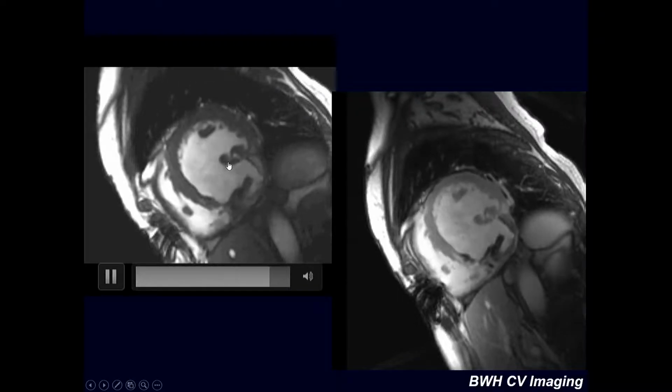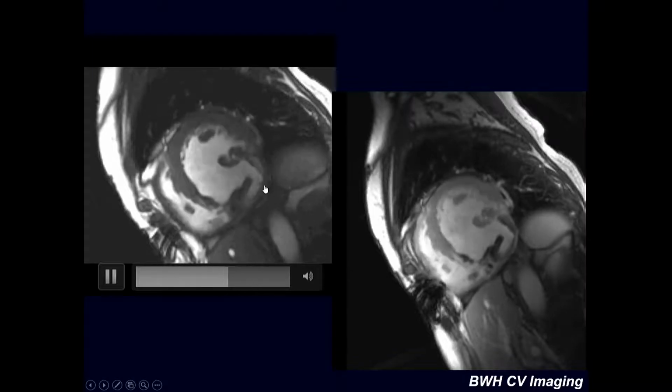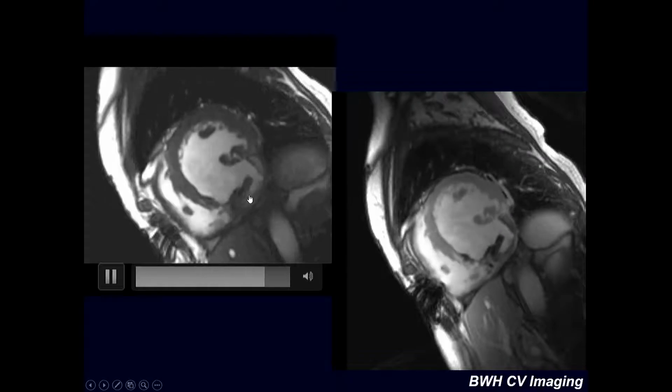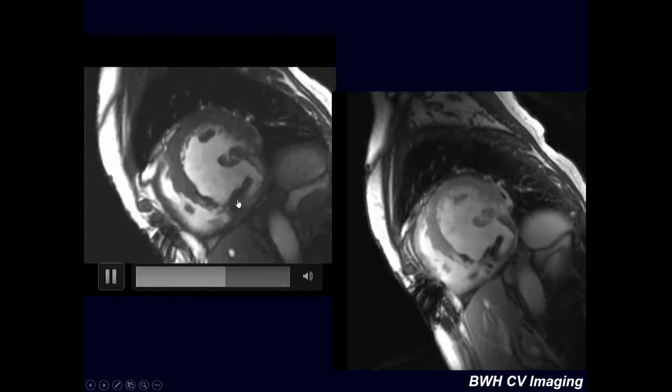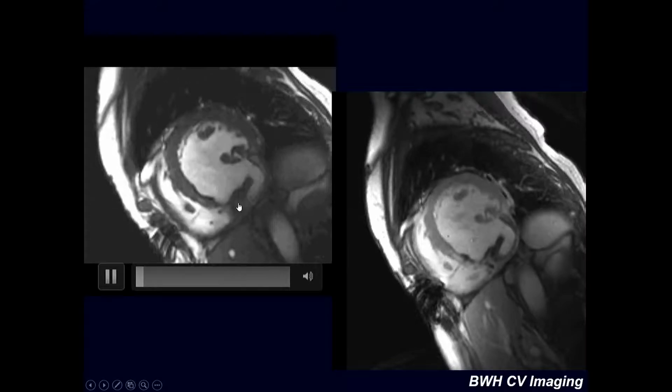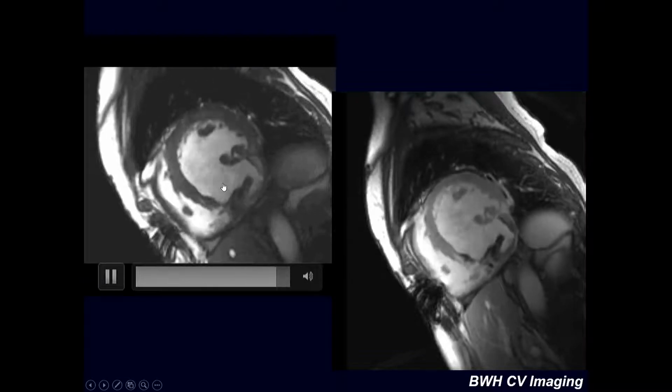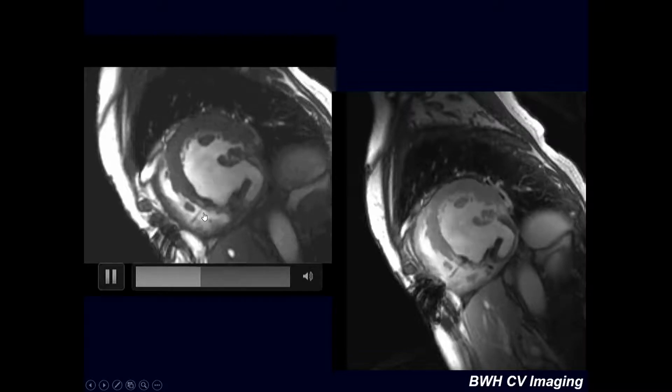This is so-called the cine imaging, the SSFP imaging. So on the left side, you can see the myocardium, the left ventricle, the right ventricle. You can see that there's a massive area that is not contracting, a massive area of akinesis. It's an aneurysmal-like structure. There's also a structure that sticks out. It's highly abnormal. There's also a VSD that's going from the LV to the RV during systole. It's a very narrow VSD.